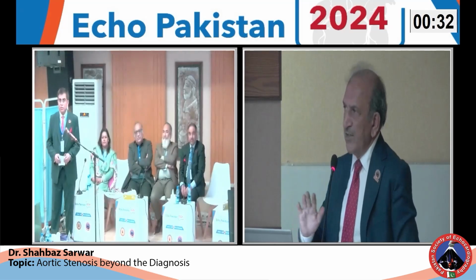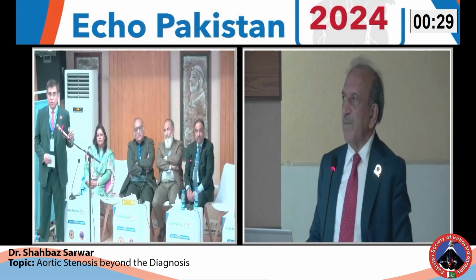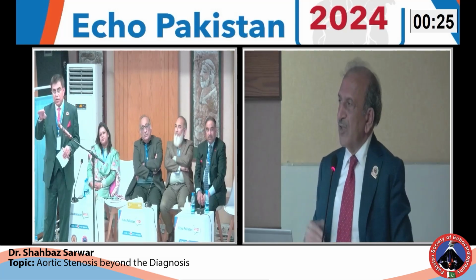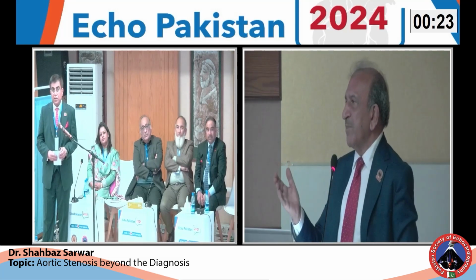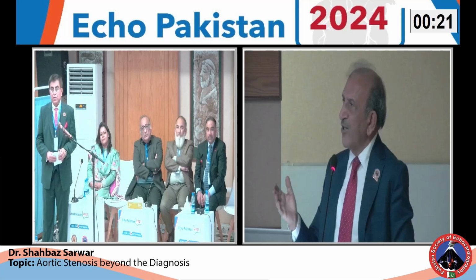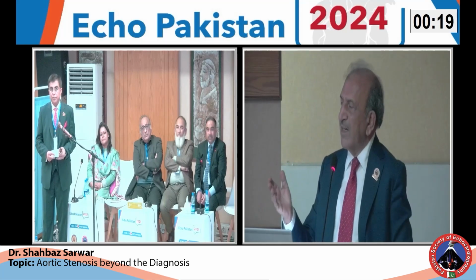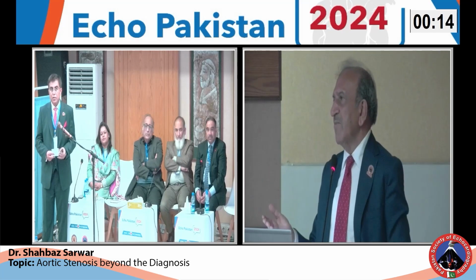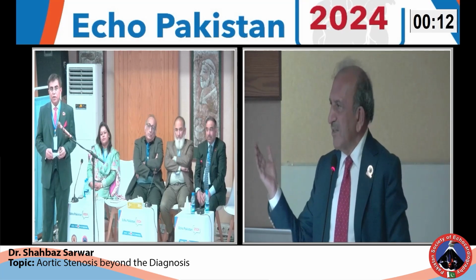Exactly. So strain should be done right away. So strain should be done in every case of AS, because that is how you are going to pick the patients who are still not showing signs of LV failure or symptoms, but their myocardium is going down. So you pick them early and send them, so that their myocardium can be saved.